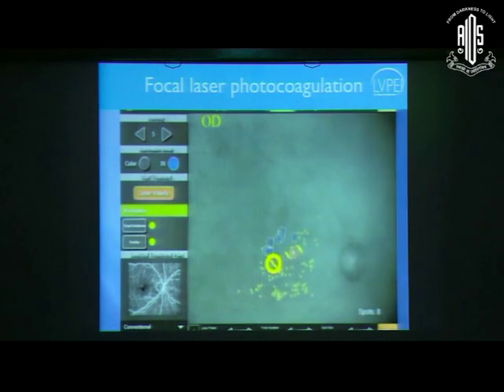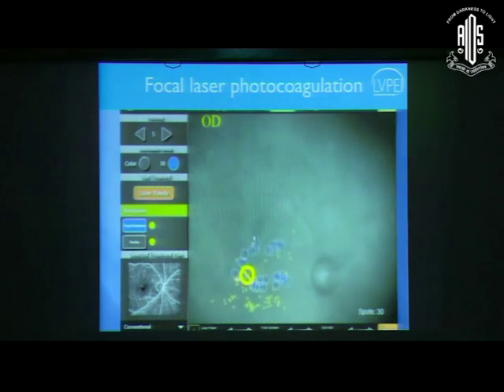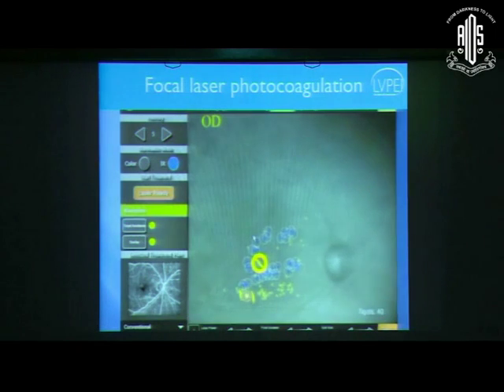And now this is the live fundus view where I have not put the contact lens and the patient is moving, and because of the eye tracking you see the laser is also moving. The laser spots are jumping to the next one on their own. I just have to press the foot pedal. And if the patient suddenly moves, this laser stops automatically.